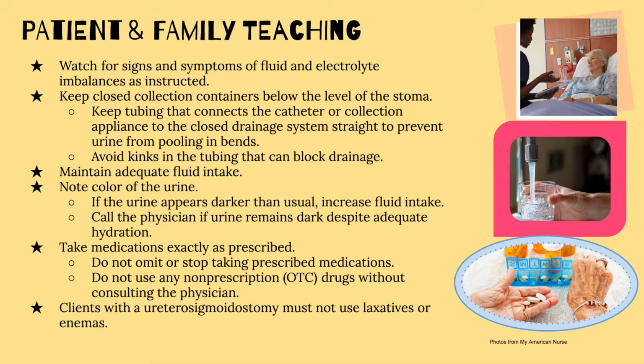As the nurse, you should teach your patient to watch for signs and symptoms of fluid and electrolyte imbalances as instructed. Now let's talk more about that collection container. If the patient is using a collection container, it must be kept below the level of the stoma. This promotes drainage and prevents backflow.